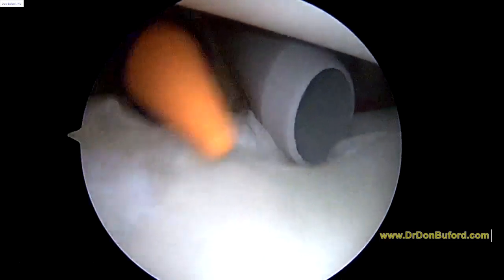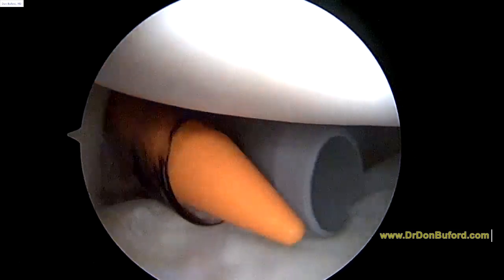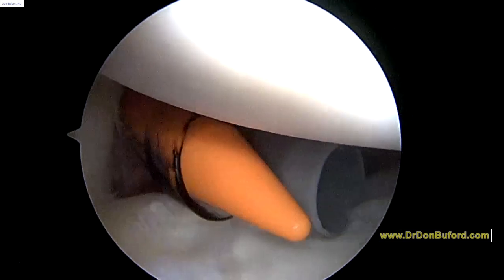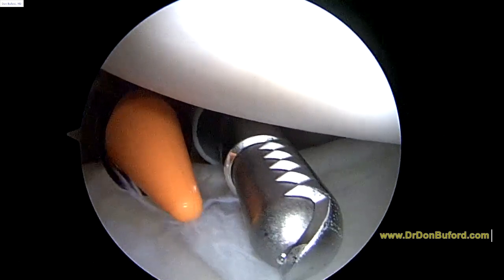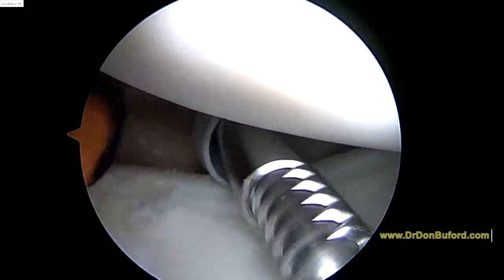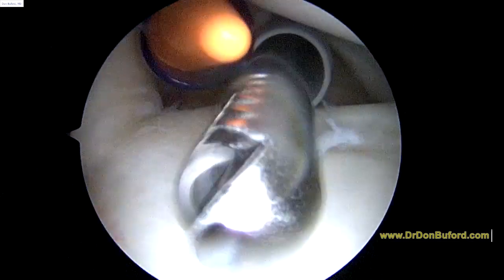We'll explore that in a little more detail in a minute. The next step for us is actually going to be to remove some of the torn labrum so we can see a little bit better. Hold the camera very steady here. And then we're going to switch the camera and get to work in the back of the shoulder. So here's the first step. We're just going to remove a little bit of the torn labrum just so it doesn't block our view.